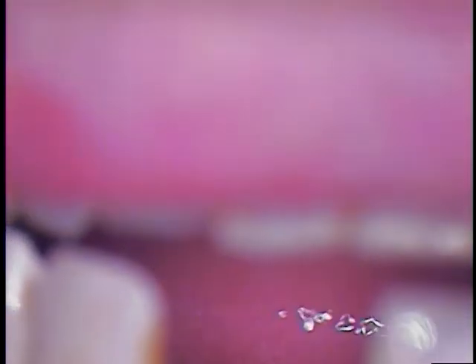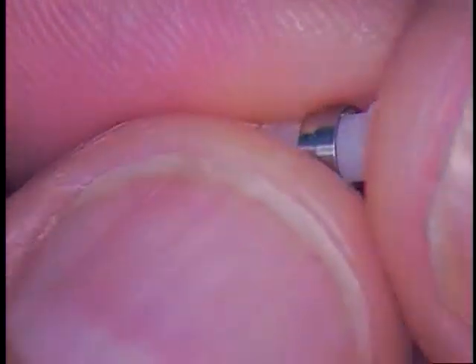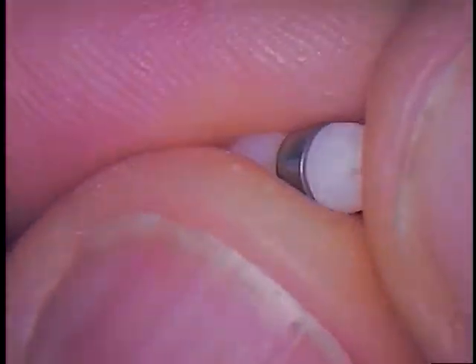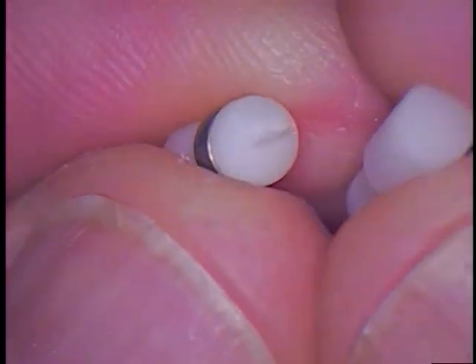So we have a lot to pick from. We don't know the length, so once it comes out, we'll know the length. We're all going to know about these little sleeves, transmucosal sleeves, which are also in there. So a combination of a sleeve and an implant. This would be the healing abutment, which may be all we need, or a combination.